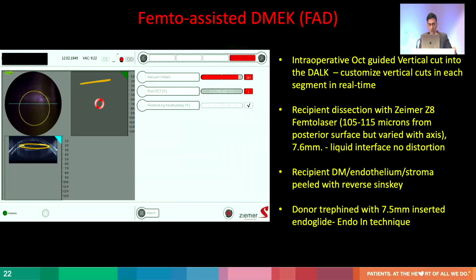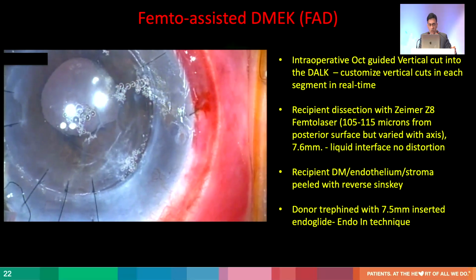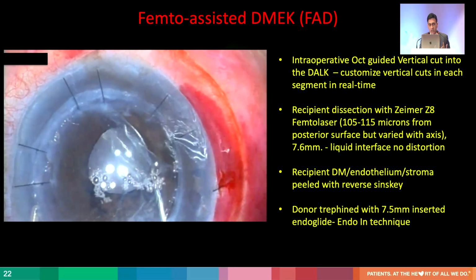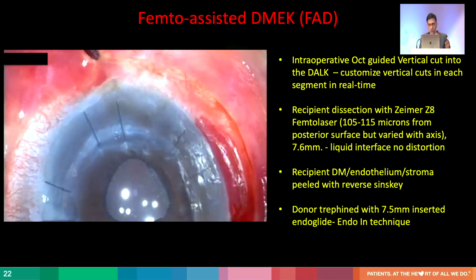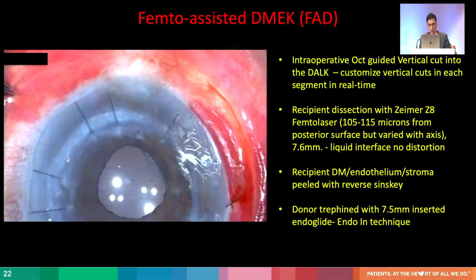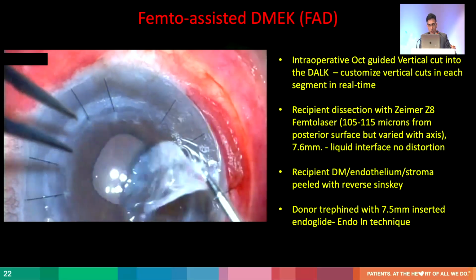You fire the laser. So the laser is now firing from the anterior chamber vertically upwards into the DALK tissue. You can see the bubbles there around that's created by the femtosecond laser. Then using a Sinskey hook, I gently tease away the edge of the stromal tissue. I'm gently dissecting it. Now, where the sutures are, of course, it'll be a little bit tighter with the cutting from the laser itself, but you can see you've nicely removed that tissue. You can see on the surface, that's the scar. So you can see the scarred area over there, so now it's removed.